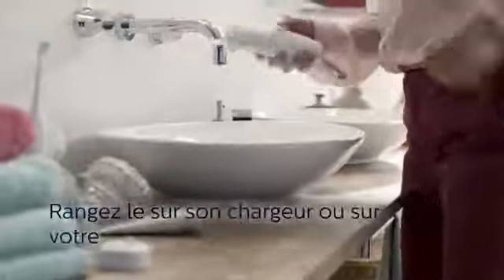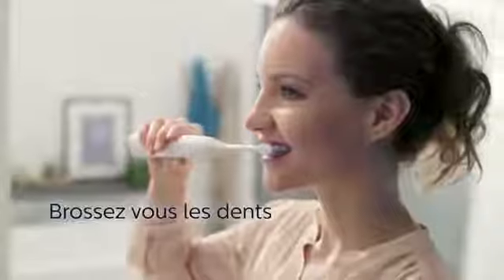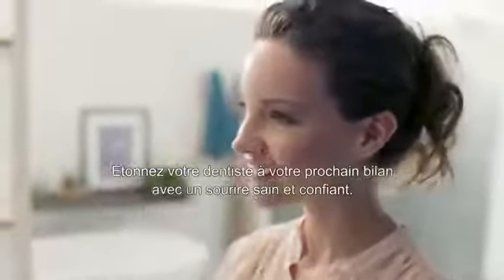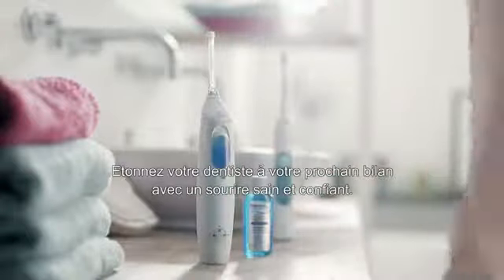Store on the charger or in your cabinet after each use, then brush your teeth. When fully charged, its battery lasts up to two weeks. Surprise your dental professional on your next checkup with a healthier and more confident smile.